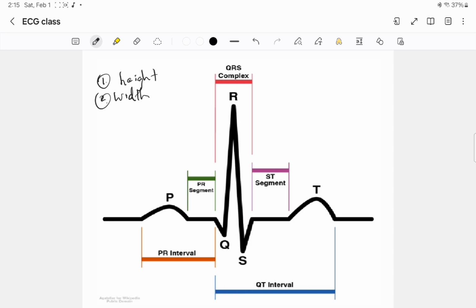But for now, at the end of this video or the next few videos, we're going to look at some ECGs so that we can just get a vague idea of what's normal, all right? But it's just for you to know that we have to look at the P wave height and width, and we look in two leads, V1 and lead 2, which is pretty easy, right?